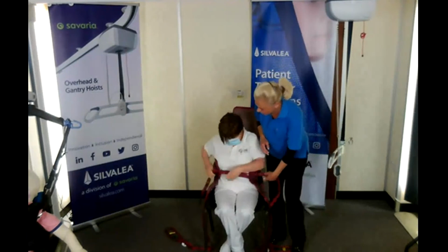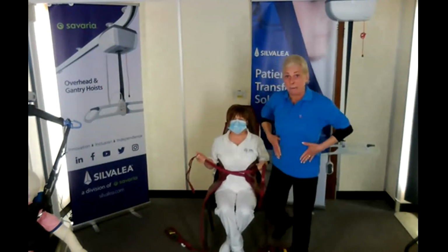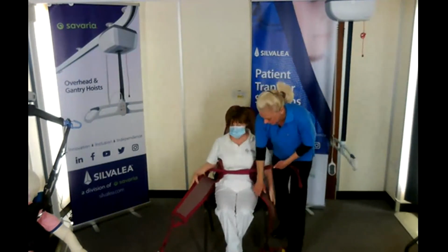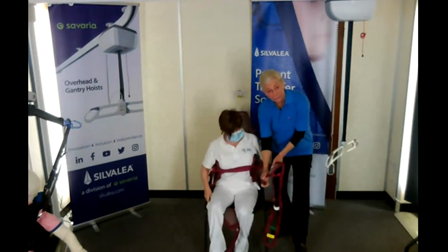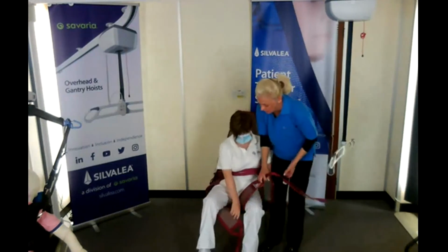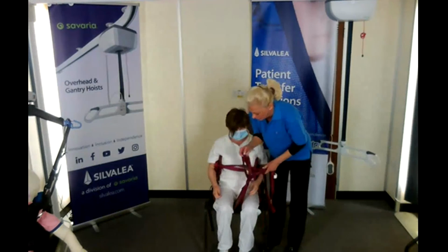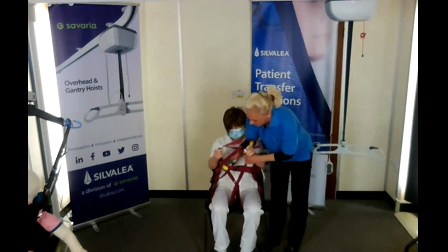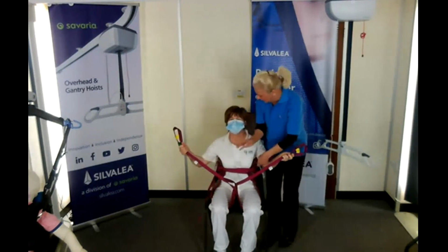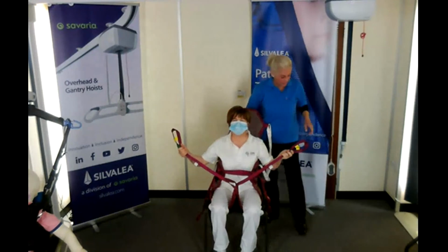So Jude's just doing the chest strap. We've got a chest or thoracic support here that's wrapping around the body and then crossing over into the loops on the opposite side. Leg sections also have foam in, so they are easier to get in if you've got a tight situation, and then we cross them over. So we've got legs, we've got thoracic section, and we've got a counterbalance. So three tapes to factor in there.